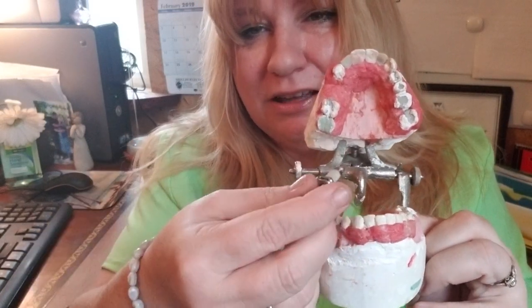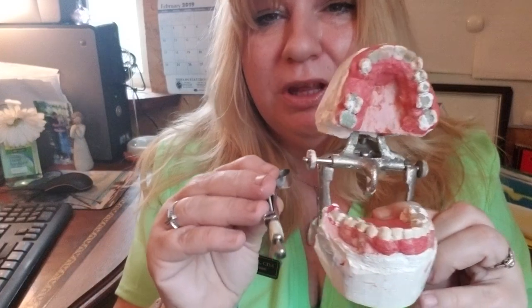Just keep tightening it — put your finger on it to hold it there, then tighten them up. Notice it's sticking outside the mouth and not down the throat. Just like when you're taking X-rays, you're going to use it for the lower right with the yellow posterior ring kit — same with your Toffelmire. Lower right equals upper left.